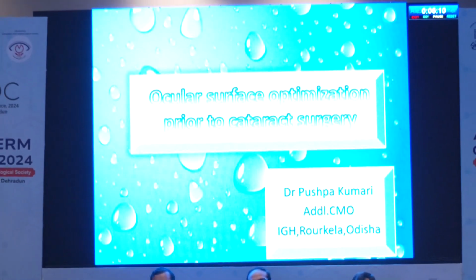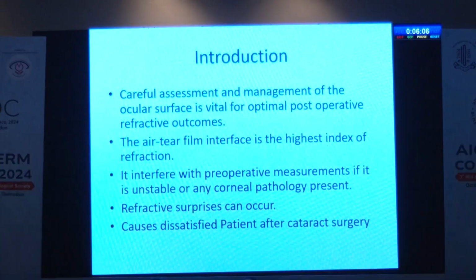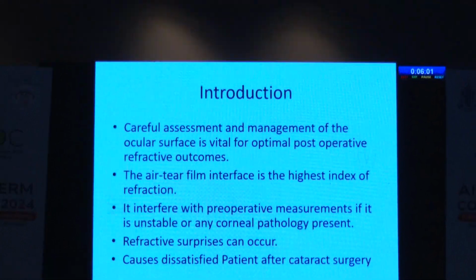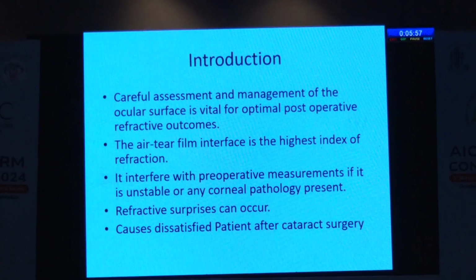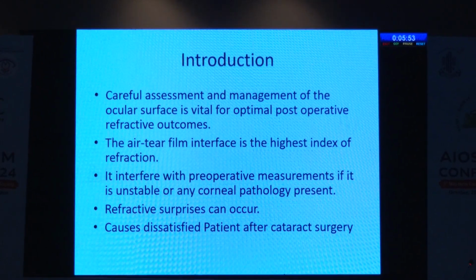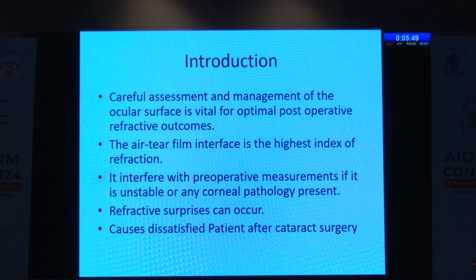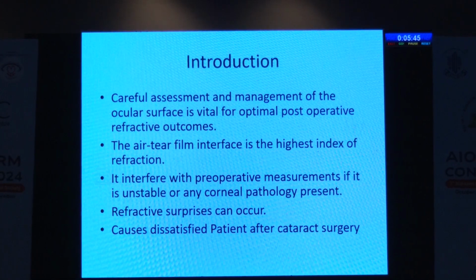So that's why I have chosen this topic. Though it is not important for all purposes, for me it is very important. Careful assessment and management of the ocular surface is vital for optimal post-operative refractive outcome. The air-tear film interface has the highest index of refraction. It interferes with the pre-operative measurement if it is unstable, or if there is any presence of corneal pathology.